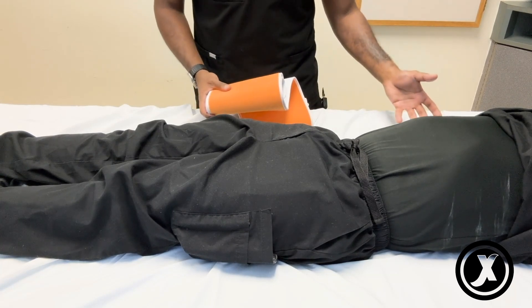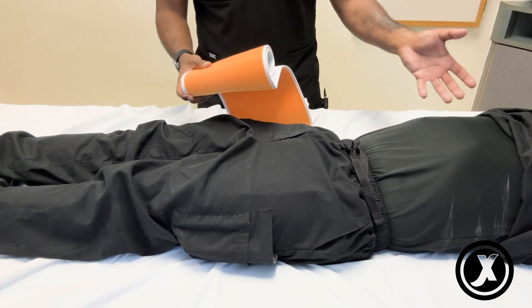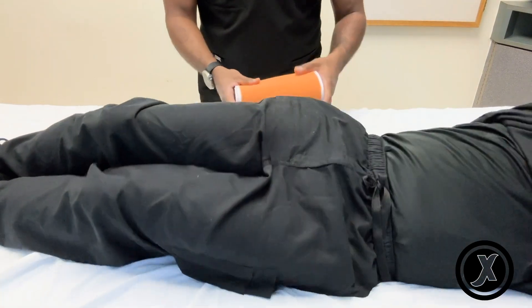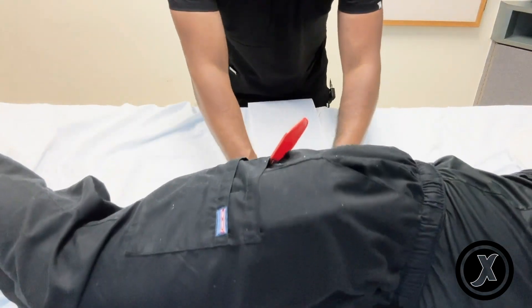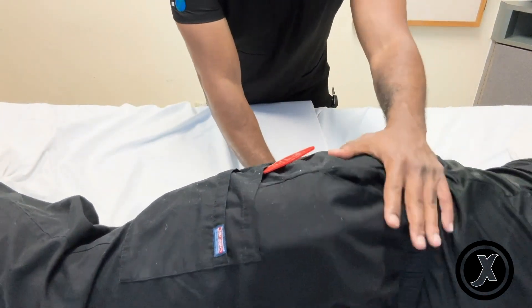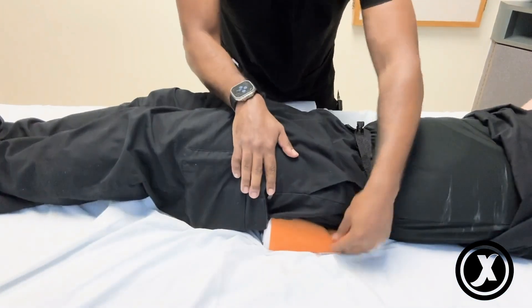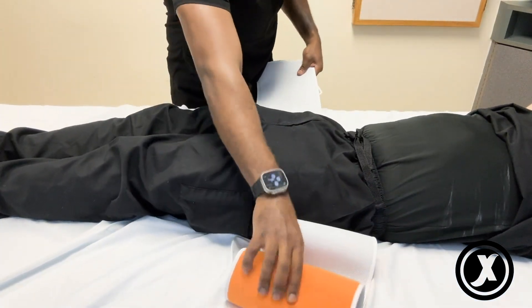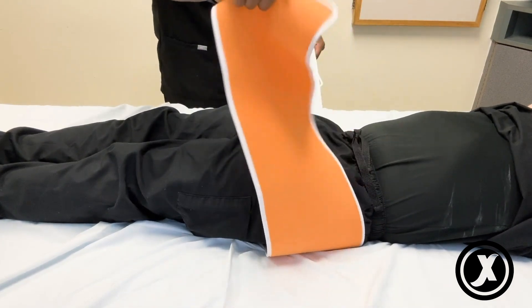And then someone is going to log roll this patient to their right side. Please turn to the right side — thank you. And then roll it back. You align the two sides together.